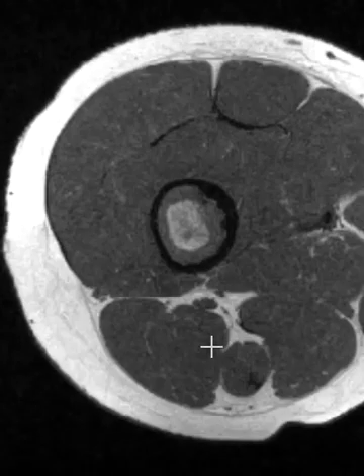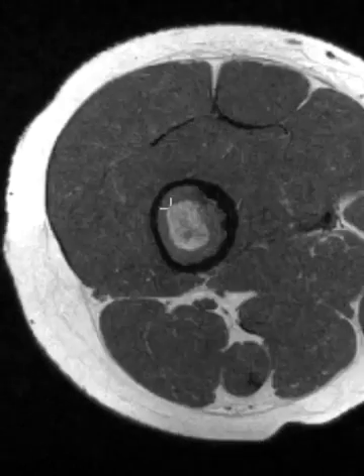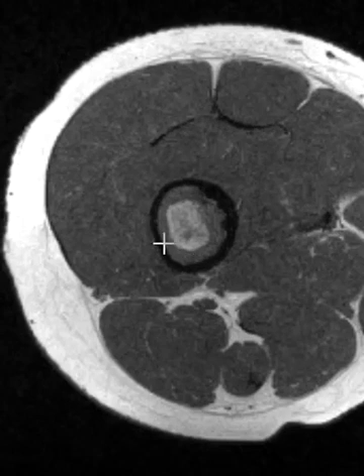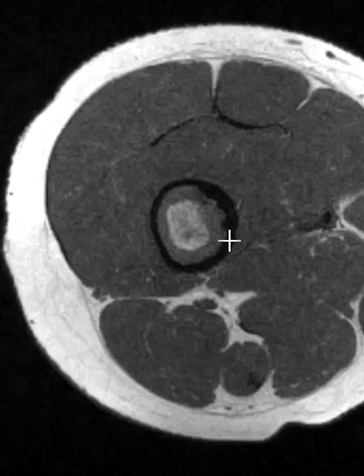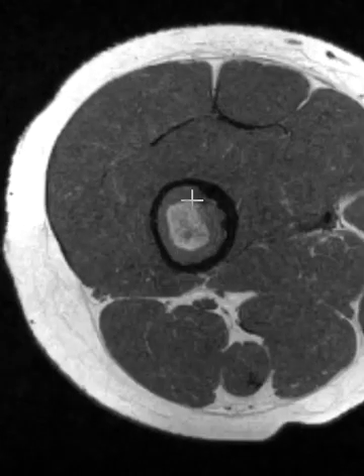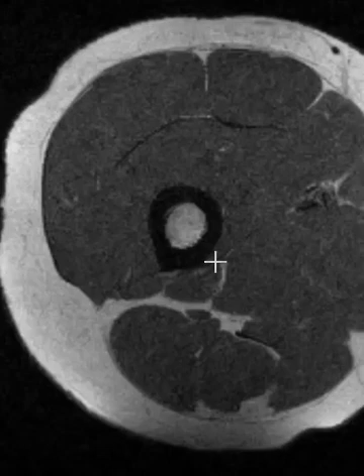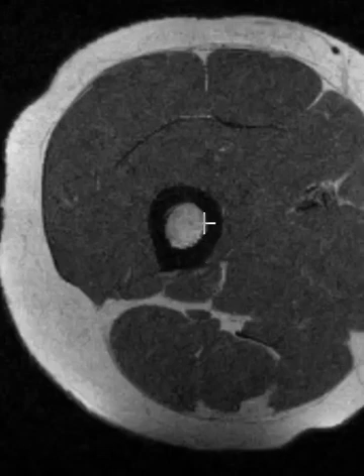On this T1 weighted sequence, we see that there is some fatty marrow centrally within it. We see that the cortex is thin along the back, lateral and anterior parts. The medial side is kind of funny lobulated, so there's endosteal scalloping and thinning, but there's also marrow within this. When we go superiorly, we get into the normal marrow, normal cortex.